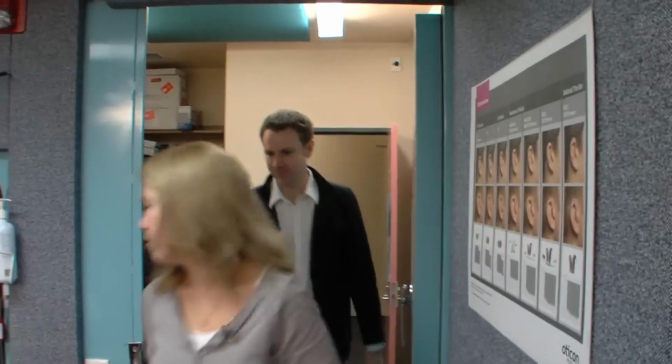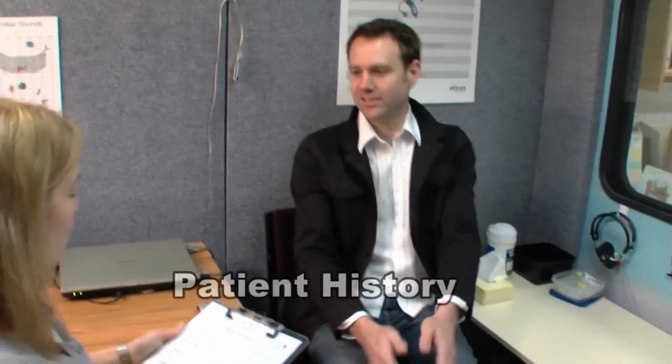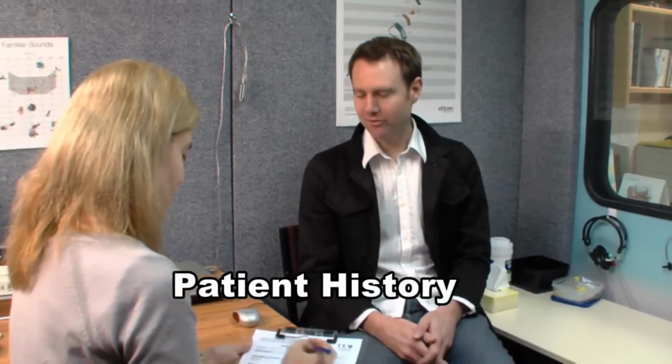We're going to follow a typical audiometry test session with an adult client. And so, what brings you in today? Well, I'm having a bit of trouble hearing in background noise. I listen to a lot of live music.